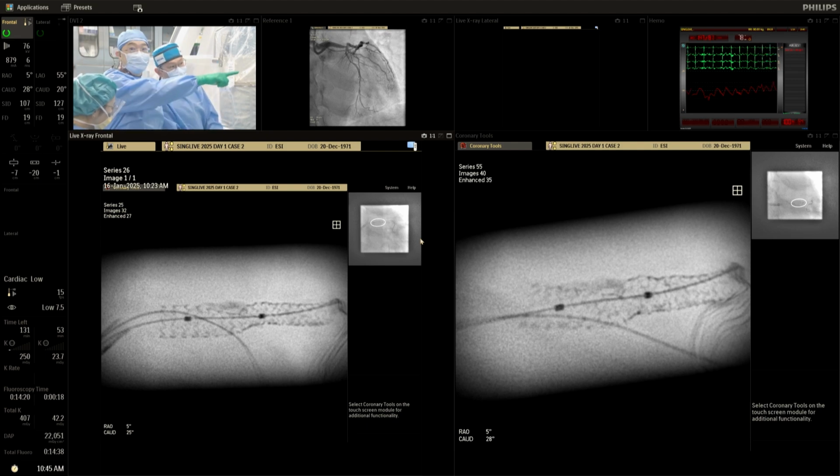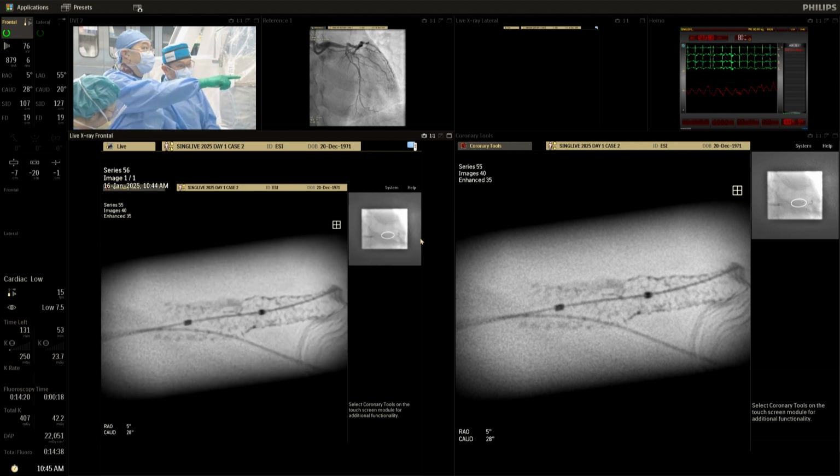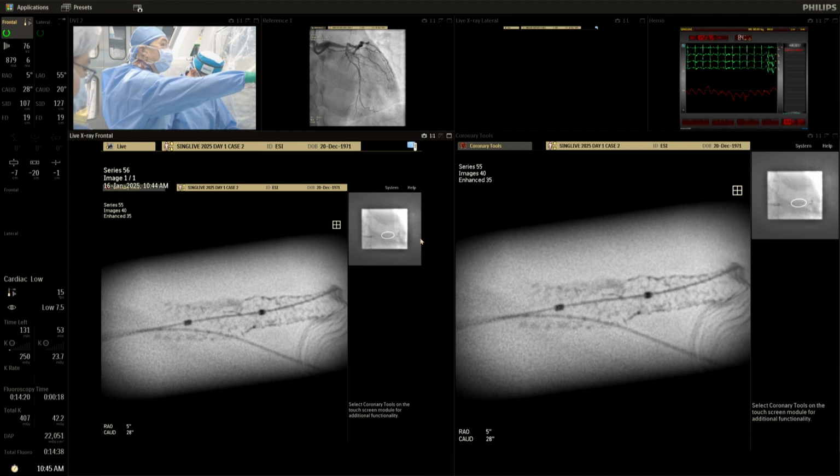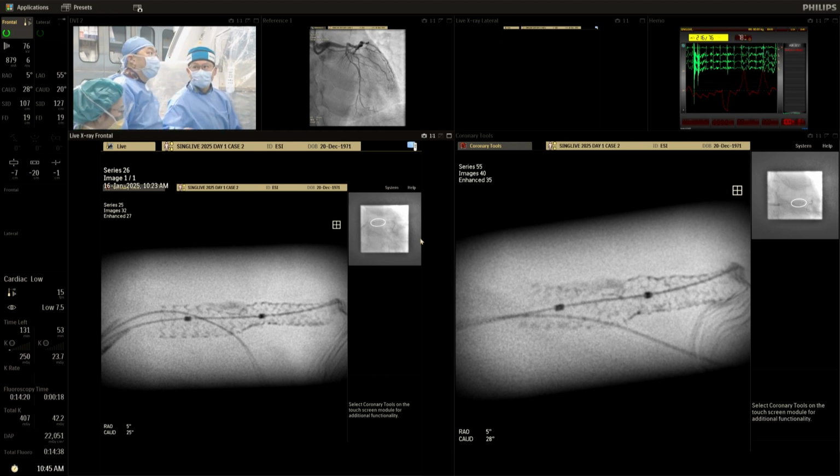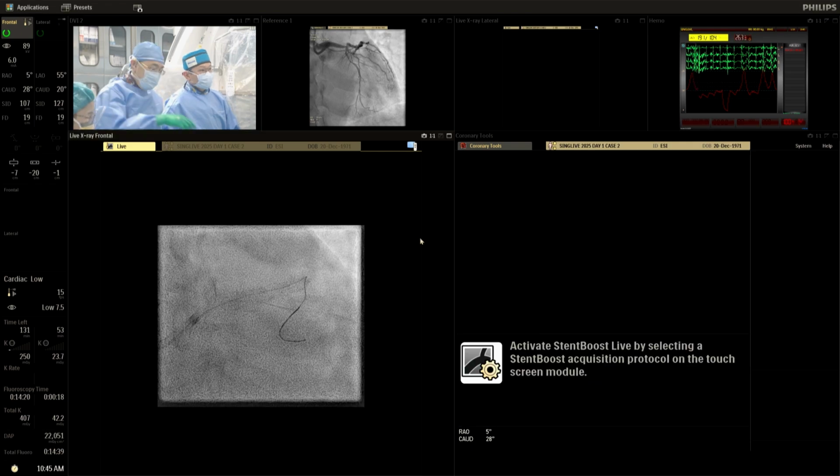This is before, right? This is after. This is exactly, yeah. This is this one. This is before? Yeah. Pot. See one. Yeah, no, I think we got time.